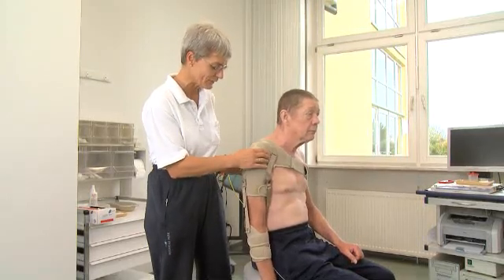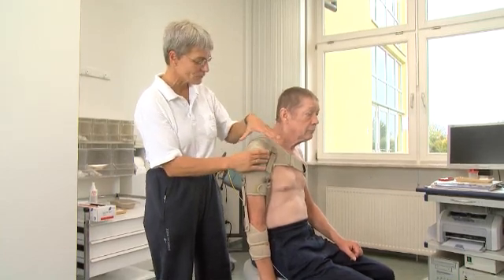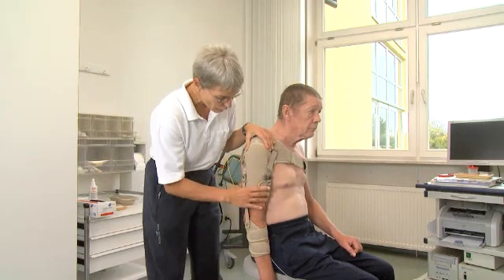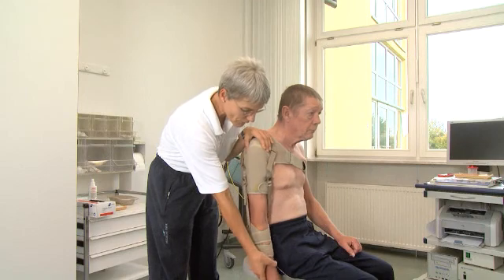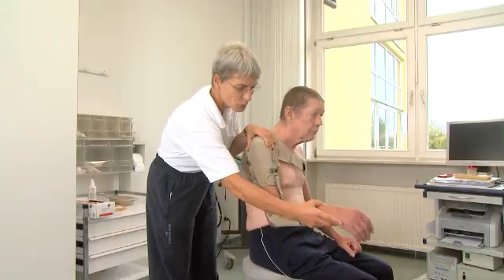With the Omo-Nurexa support, the humerus head is more securely positioned in the socket for improved alignment. This enhances patient security and support. We have the elbow in extension and the forearm in medium supination. This also prevents excessive proximal leverage movement in the shoulder joint.